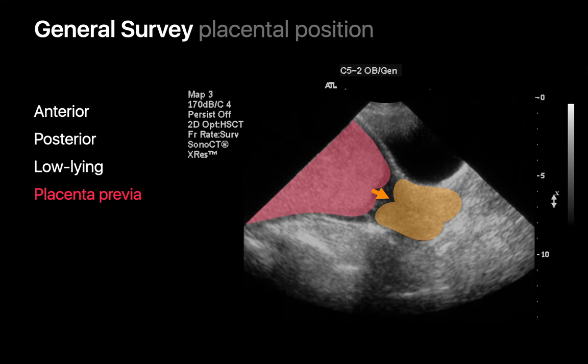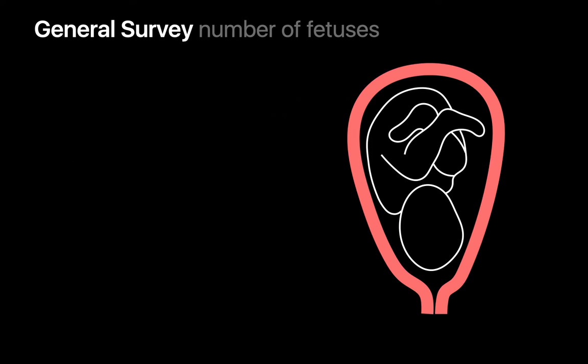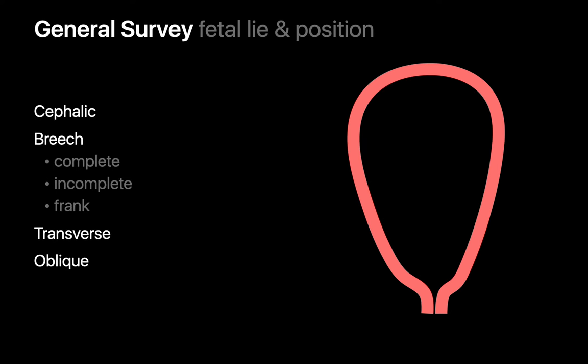Placenta previa occurs in about half a percent of pregnancies and can be associated with many serious complications, including maternal hemorrhage before or after childbirth, intrauterine growth restriction, fetal hypoxia, and fetal death. After inspecting the placenta for any other anomalies, our general survey moves on to an assessment of the number of fetuses within the uterus and then the fetal lie and position.